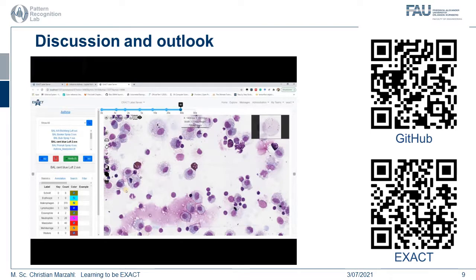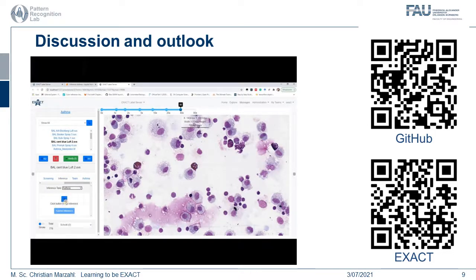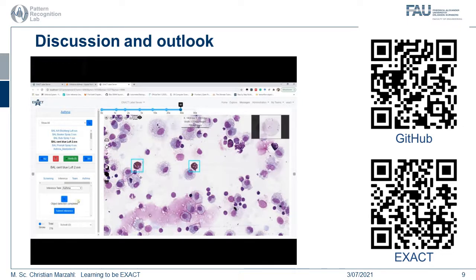In this final slide, we see a short video of the EXACT application — you can find the QR code here. We have two eosinophil cells on this whole slide image. Now we use the inference plugin from the EXACT server, load the asthma detection model and perform inference. The model is downloaded and inference is performed. The model was able to find these two eosinophil cells. Now we can submit the information after checking them and save them to the server. Then we can go into an automatic mode, screen the slide, and all eosinophils will be highlighted.